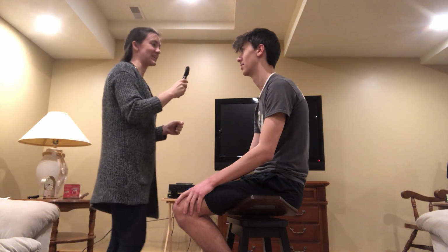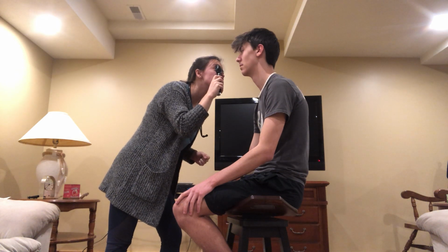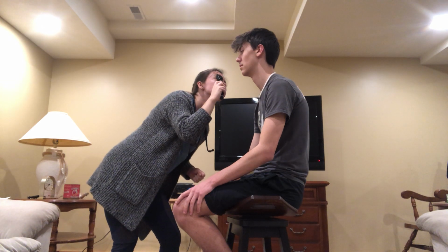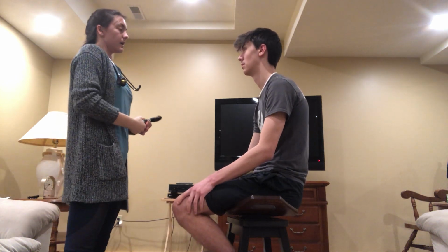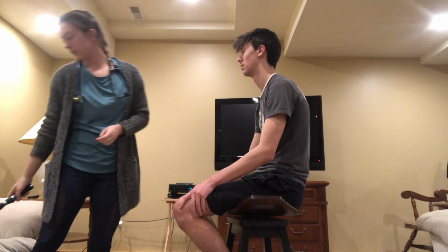I'm going to do the same on the other eye. And I should have dimmed the lights, but I did not.